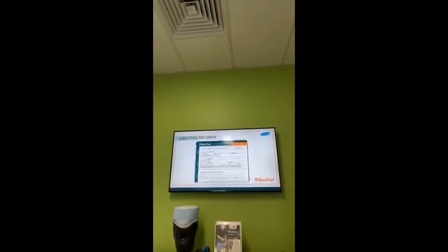So yeah, when you do press the submit button, an email comes through to us at Masson's Healthcare, and then we need to convert that scanning file to an STL file, and then we would organise with the practitioner who has sent the order a shared screen type design session, so you can help us create the liner that you need for your patient.